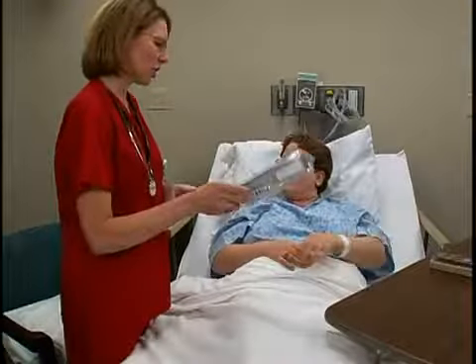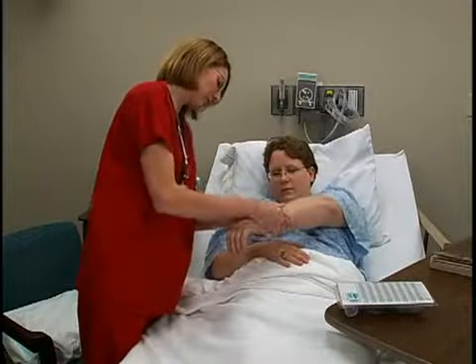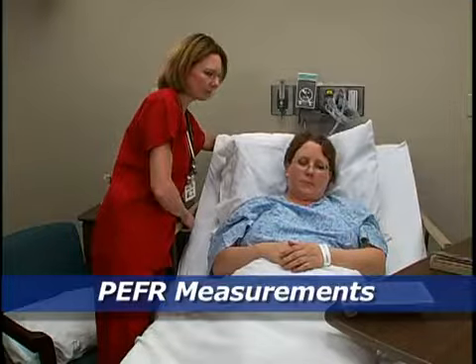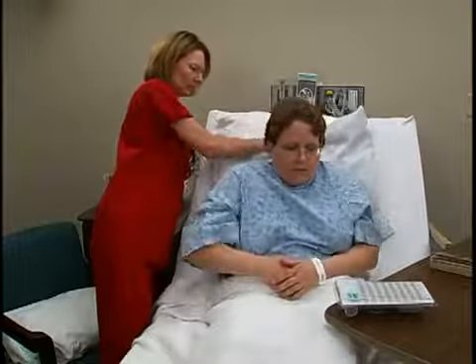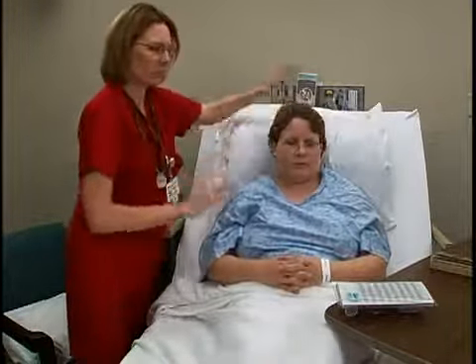We're going to check your peak flow with the peak flow meter. Okay. Let me check your arm band. To assess the effectiveness of any airway management technique, I'm gonna sit you all the way up and crack the bed, and measure the patient's peak expiratory flow rate, or PEFR. Once you've explained the purpose of the measurements, help the patient into a high Fowler's position. How's that? That's good.